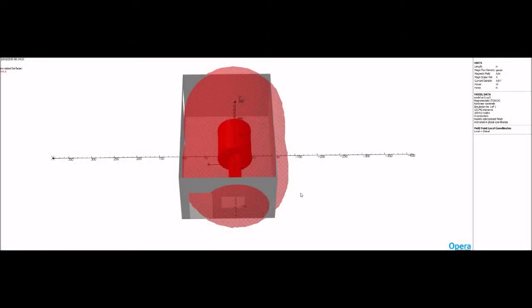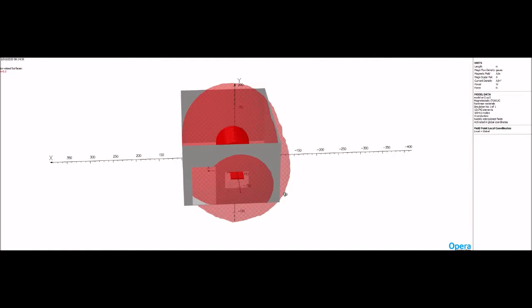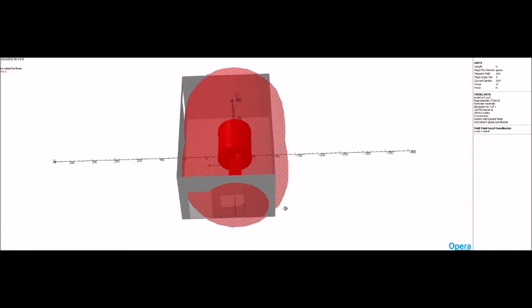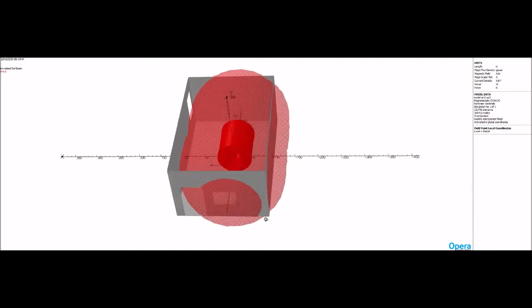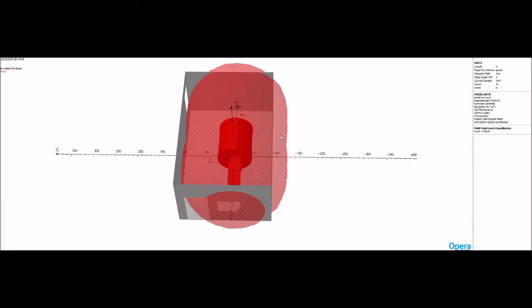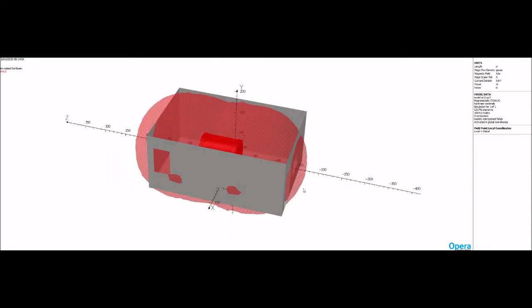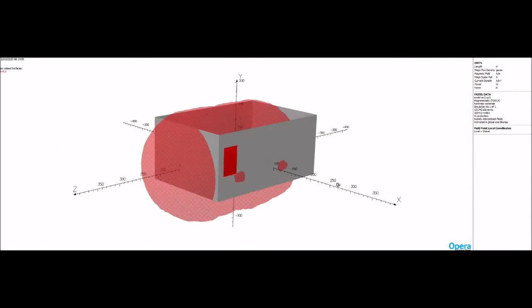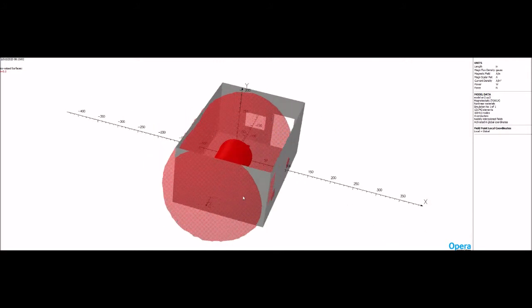This is a representation of a magnetic shield design we did using Opera modeling software. This is before the addition of any magnetic steel, and it shows the 5 Gauss line. You can see from the position of the magnet, which is slightly off to the right, that the 5 Gauss is coming out of this wall. It's coming out in front, a little bit on the side wall, that's just a couple inches, and certainly in the back.